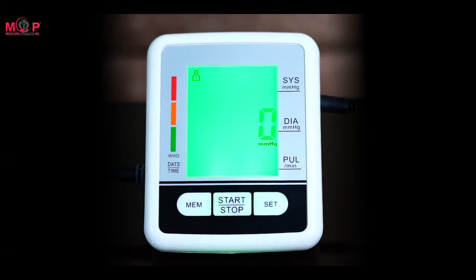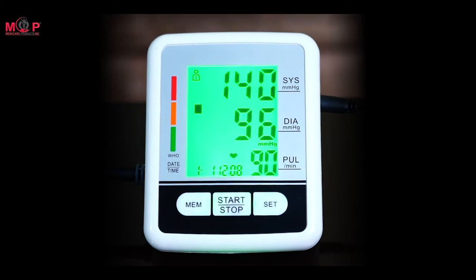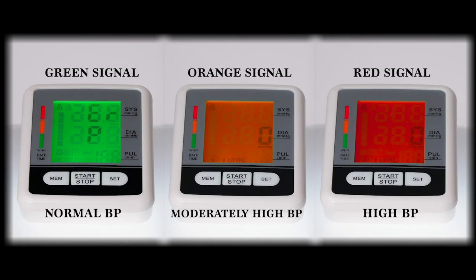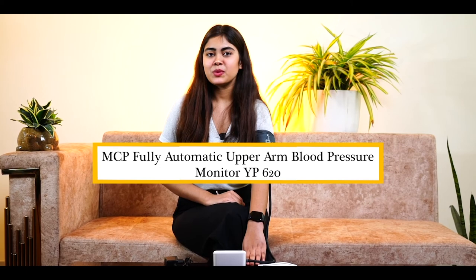Wait for the voice prompt to give you your accurate blood pressure reading. Please remain seated and refrain from talking during measurement, and keep the cuff at heart level. Your blood pressure is: systolic 140 mmHg, diastolic 80 mmHg.